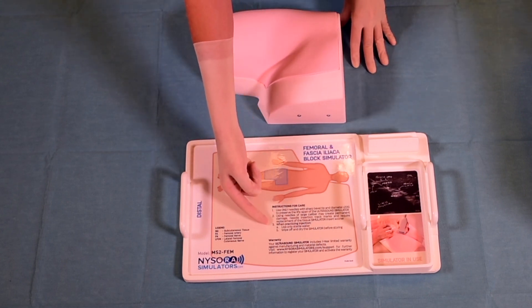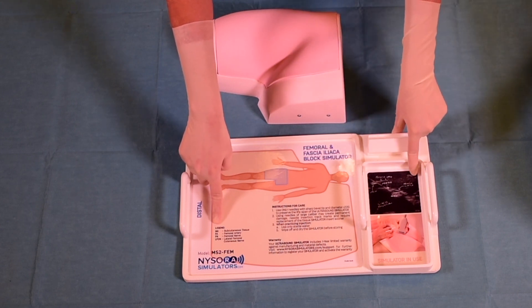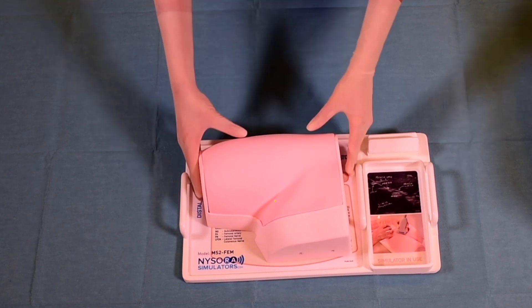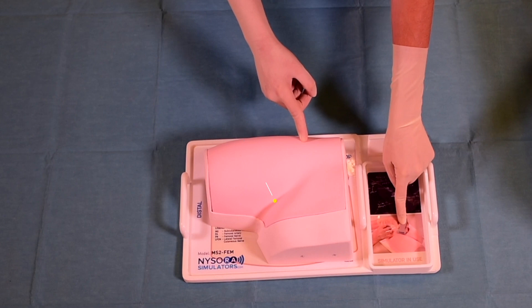Also, instructions for use are provided, as well as the abbreviations and explanations of the anatomical landmarks. The best way to use the simulator is when placed on their custom tray so that the anatomical landmark instructions and labels can be simultaneously followed.